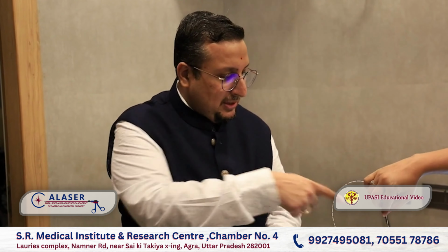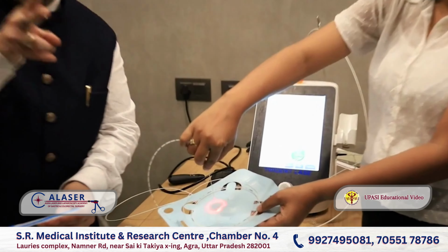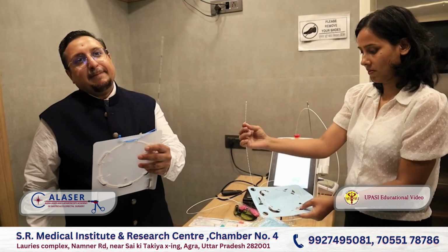Disadvantage क्या दिख रहा है आपको? क्या disadvantage दिख रहा है इसका? हमारे लिए क्या नुकसान है? This is 360 degree, right? Can you see? And the bare fiber was V-shaped. It was not 360 degree. It was straight, right? So what is the disadvantage for surgeons in this fiber?